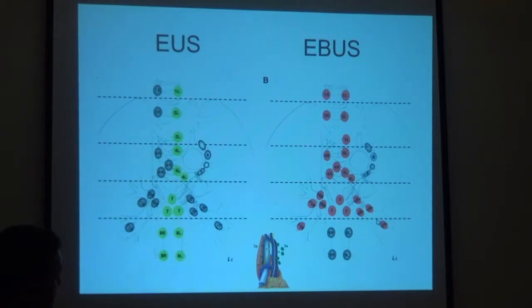and sometimes some of the segmental. For the EUS, you can get the left-sided mediastinum, the L over here, and then the subcarinal, of course, paraesophageal, and the pulmonary ligament. So the main advantage here for EUS is to get to these lymph nodes that you can't get to with EBUS. EBUS could get to all the others. And of course, you can also get to the posterior paratracheal here with both EBUS and EUS.